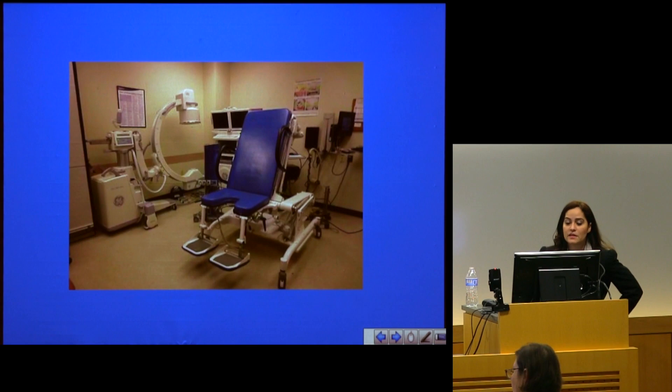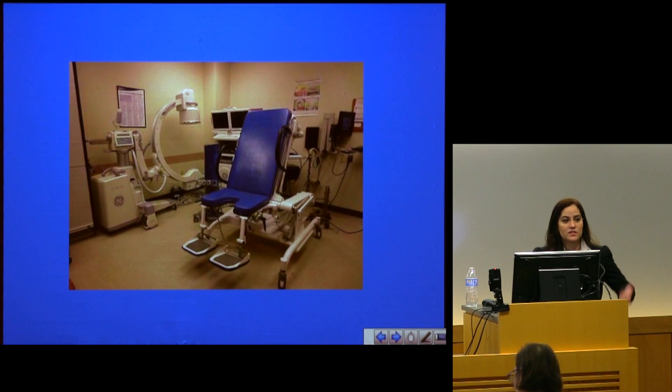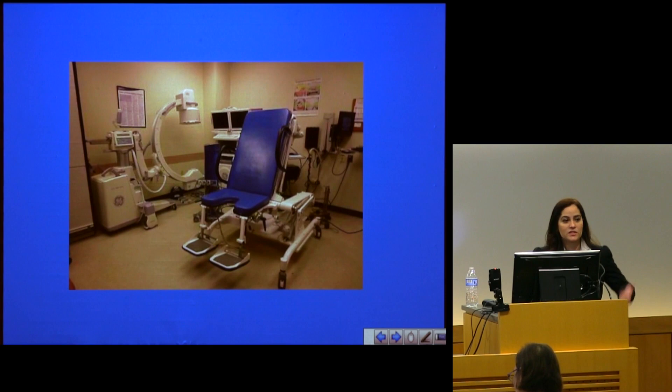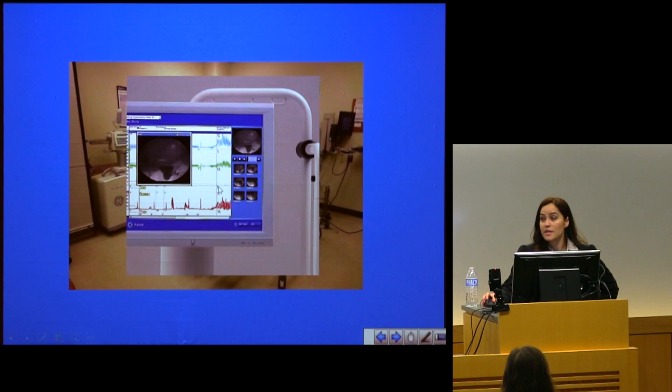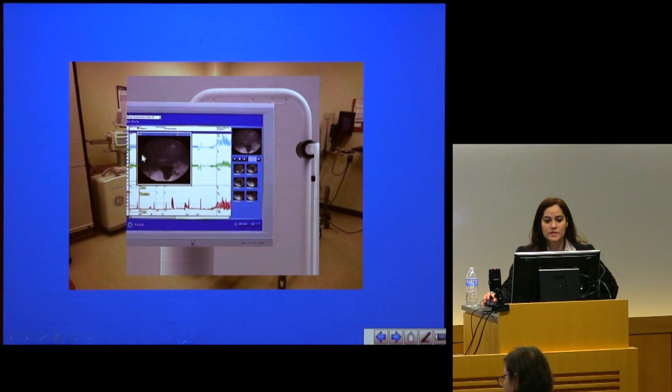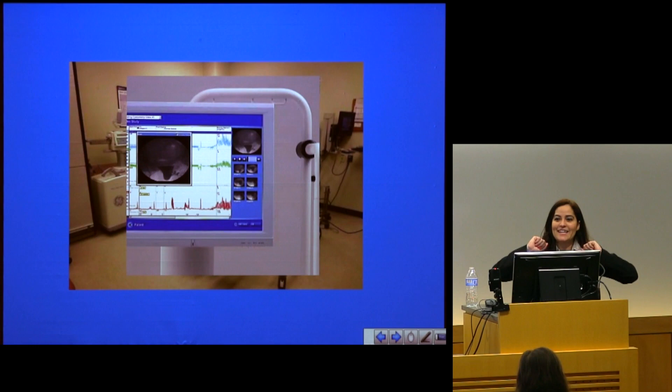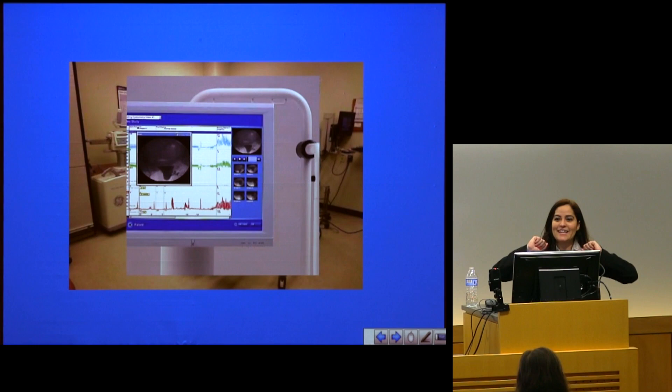This is a typical setup we have in the office — this is the chair, which can also be made flat so patients in wheelchairs without full mobility can be accommodated. We have fluoroscopy in the office, and this is roughly how the screen looks. We have the tracing here, and we're also dynamically looking at how the bladder fills and reacts, and its contour. Sometimes with a neurogenic bladder, it can acquire a Christmas tree appearance or a cone shape, which you can see during the VCUG portion.